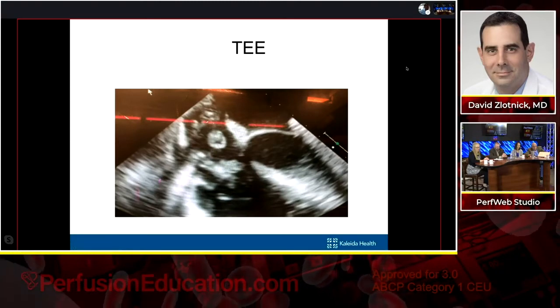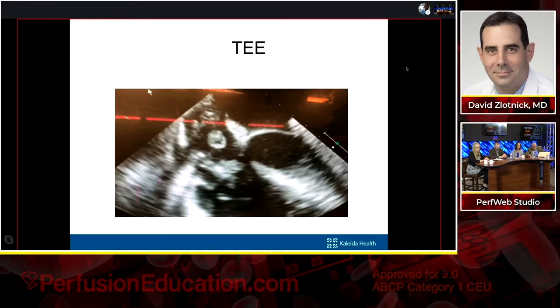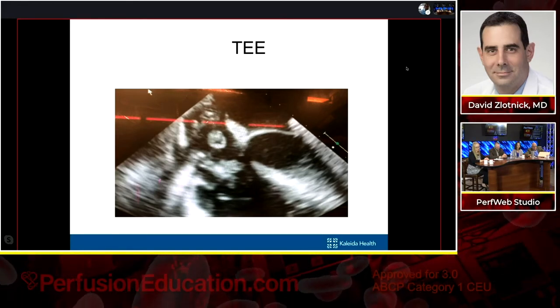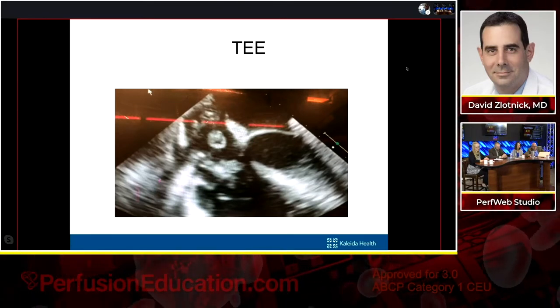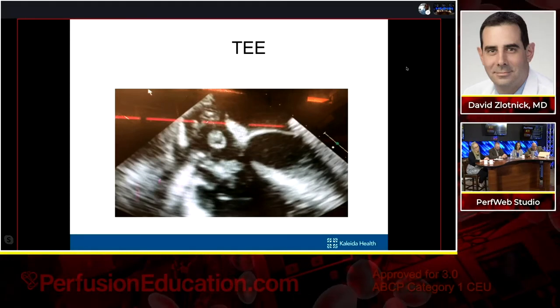So again, we got a multidisciplinary team together, and we took a look. And with this, though he was a young kid, the mitochondrial disorder was almost mimicking a neuromuscular disorder, so we thought he would be a little bit higher risk for recovery after a sternotomy. And so what we decided to do was an AngioVac-assisted laser lead extraction in this patient.